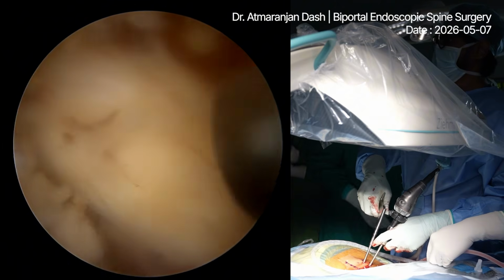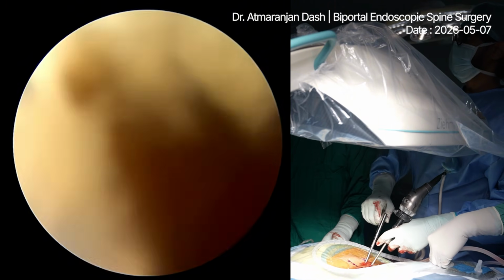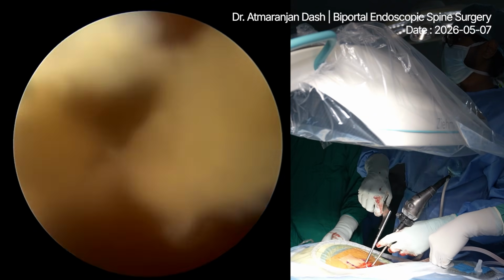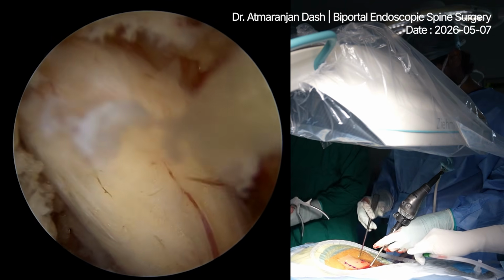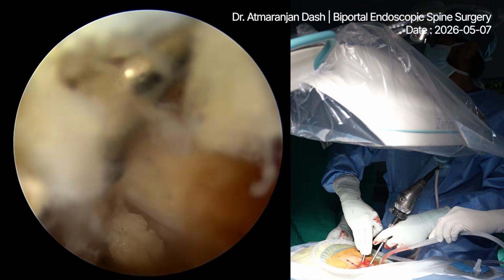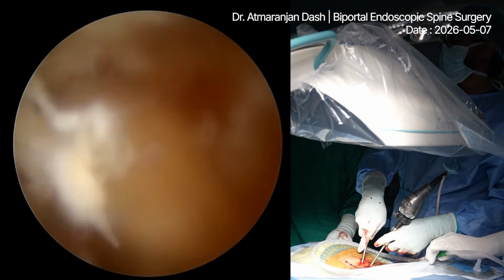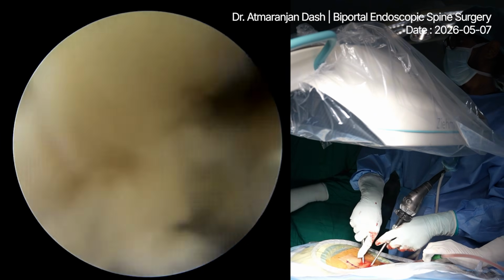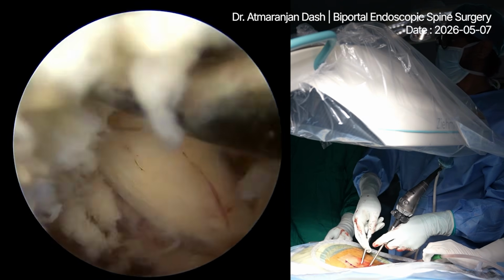On CT, you always should look for any spur. Pedicle has spur. Okay. Curette it, please. Saline. So I am making the foramen wider, which is known as foraminoplasty. So foraminoplasty will give some adequate space to the nerve.